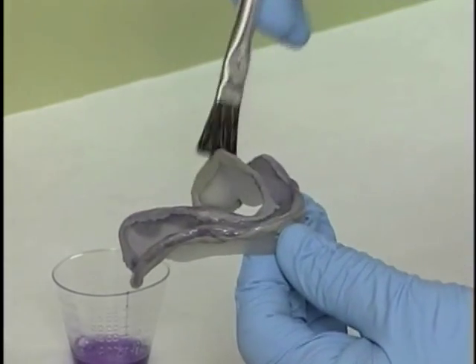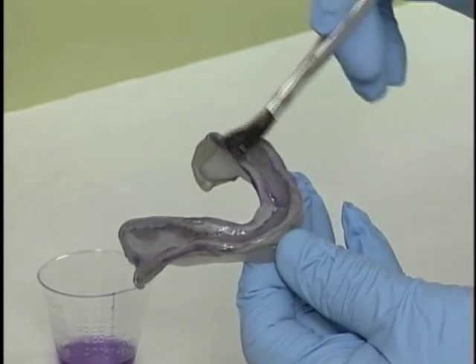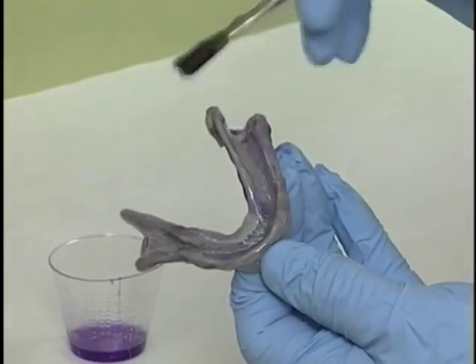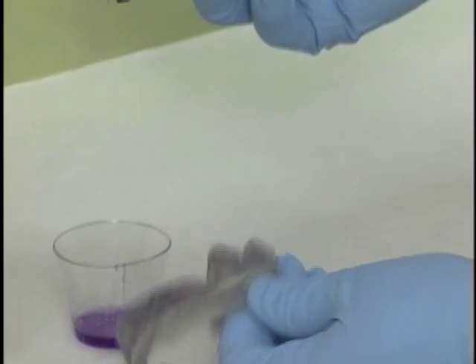Okay, so we're painting the tray, getting a nice coating of it, making sure that we get it up onto the compound and the peripheries. After painting the tray with the adhesive, I like to let that adhesive set for about 3 to 5 minutes before loading the tray with the final impression material.